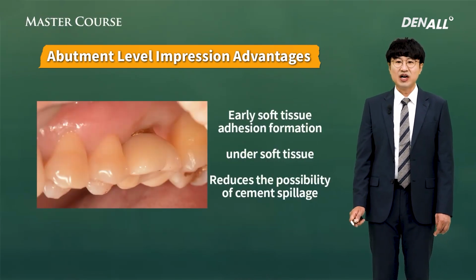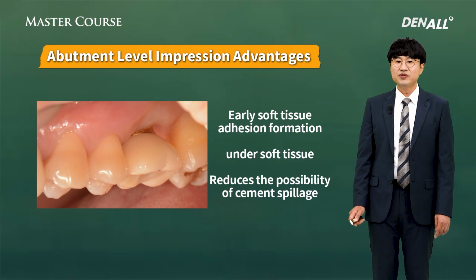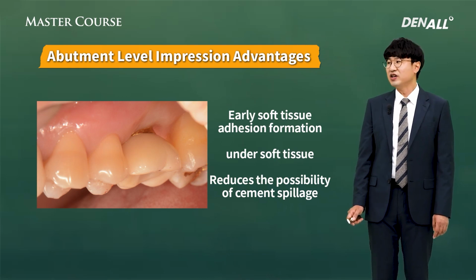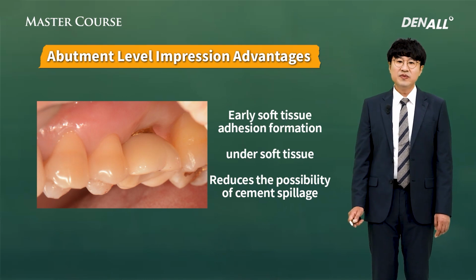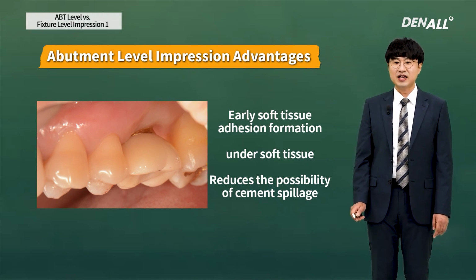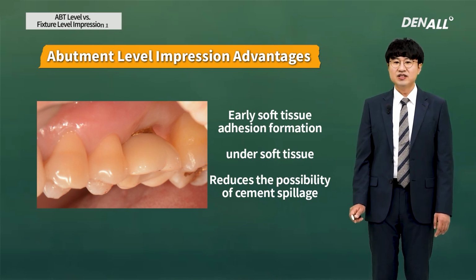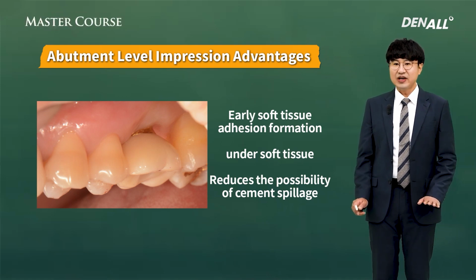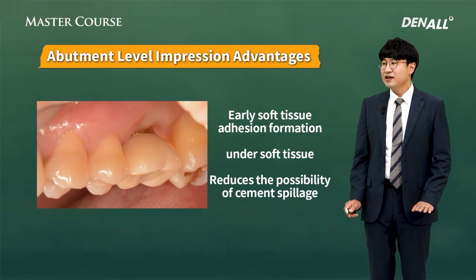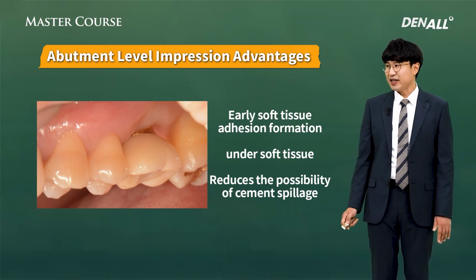However, as the stock abutment was used and it was created supragingivally, as you can see in this case, there could be some defect on the buccolingual side. If all margins are to be located supragingivally, and there is irregularity buccolingually and mesiodistally, then you have to use an abutment with a high gingival height. To improve form, a lower subgingival height would give favorable results, but in the case of a supragingival margin, impression taking is easy, while with a subgingival margin, taking a direct impression can become very difficult.